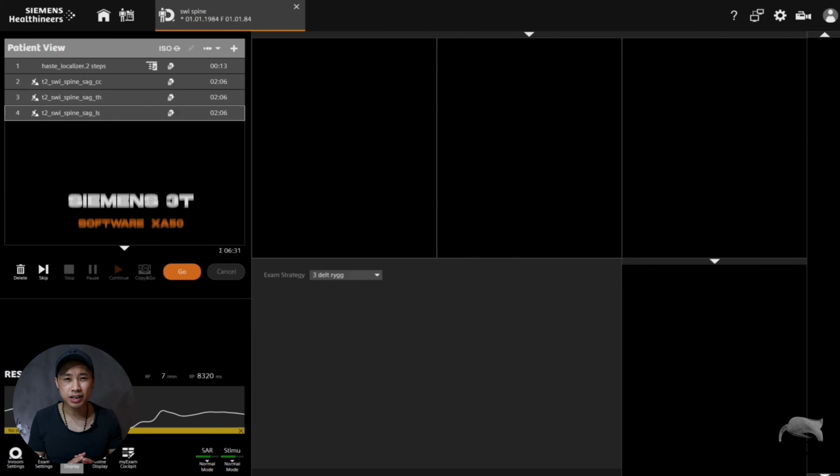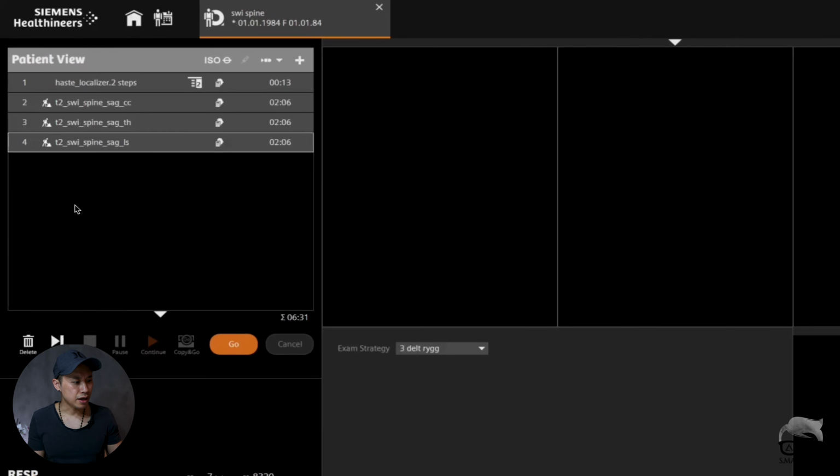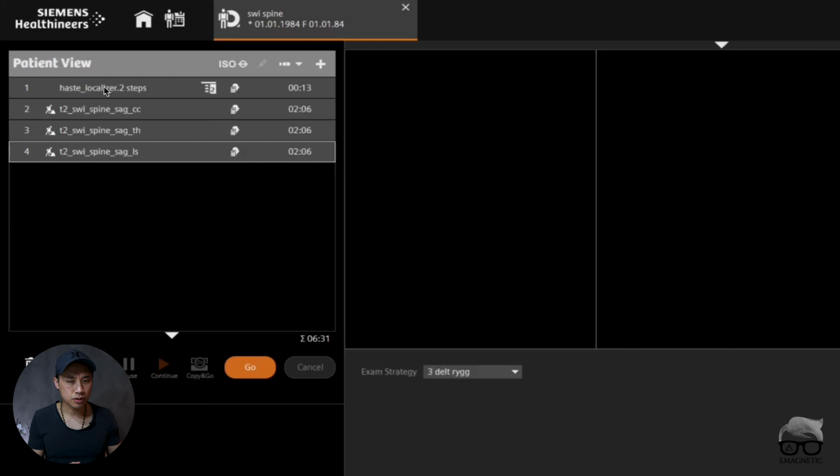All right, we currently have 3T Siemens scanners. However, most of the basic stuff I'm going to show you today, I'm pretty sure you can adapt to any vendor. So let me show you. What we have here first is a localizer, a two-step localizer covering the whole spine. And then we have SWI of the spine divided in three steps: cervical, thoracal, and then lumbar. So let's run this localizer.